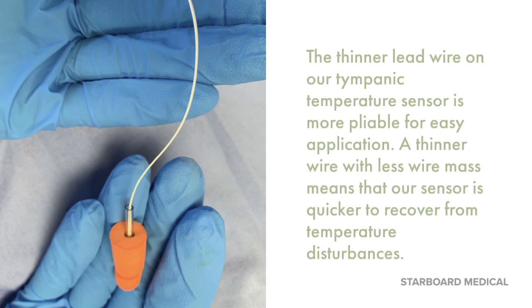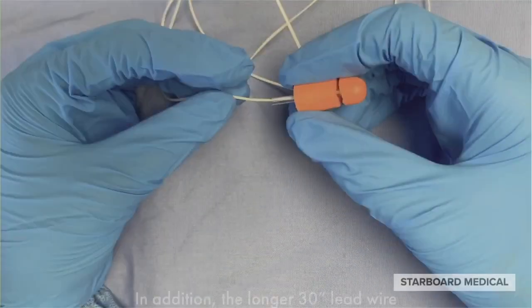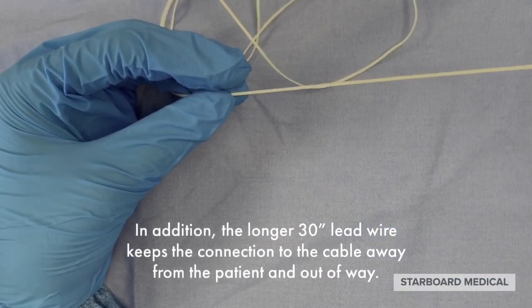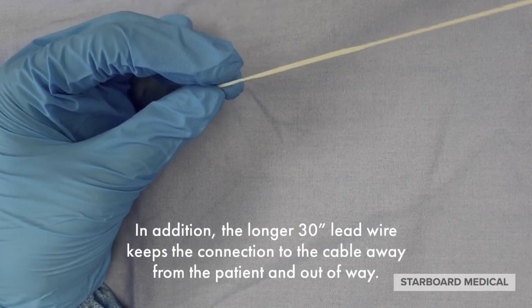A thinner wire with less wire mass means that our sensor is quicker to recover from temperature disturbances. In addition, the longer 30-inch lead wire keeps the connection to the cable away from the patient and out of the way.